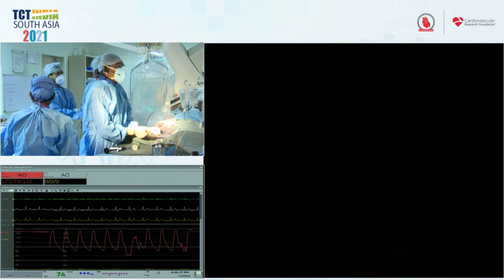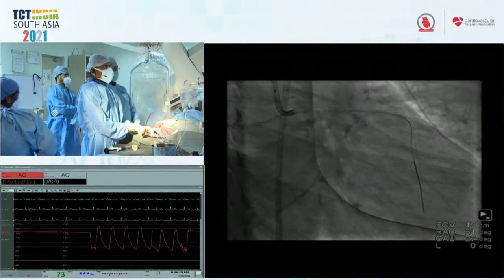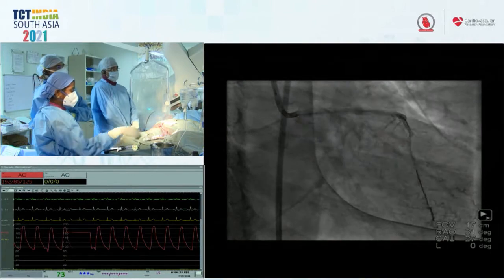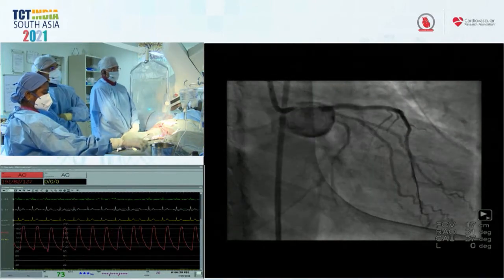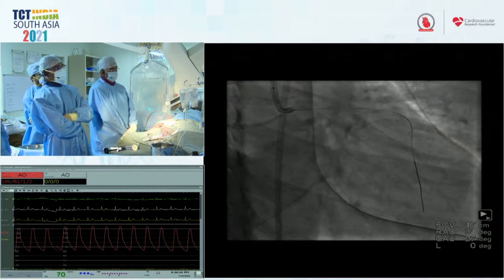Ready? Yes, sir. Still at that area. You think it is recoiling? What do you think it is? Well, it looked better. It's definitely dilated it better. You've now used a balloon at 20 atmospheres sized to the EEL on two modalities. You're done. The hazard of going oversized here is a rupture.